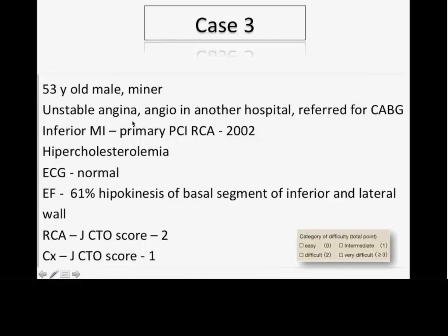Leszek, one question that was asked from the chat: do you ever use side hole guides for vessels like this to prevent dissections like this, or you don't usually use them? You know, this is a matter of discussion because some operators use them very often. I personally prefer, for such cases as we saw, the guide with the side holes, of course. I personally will use the guide with the side holes.